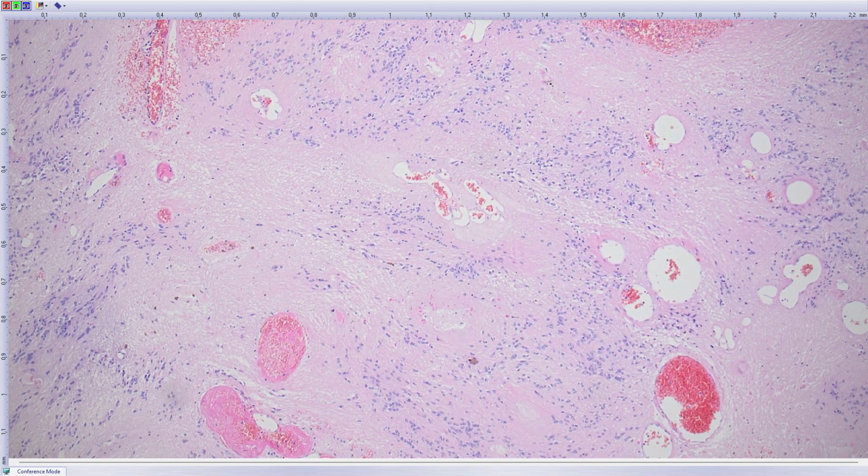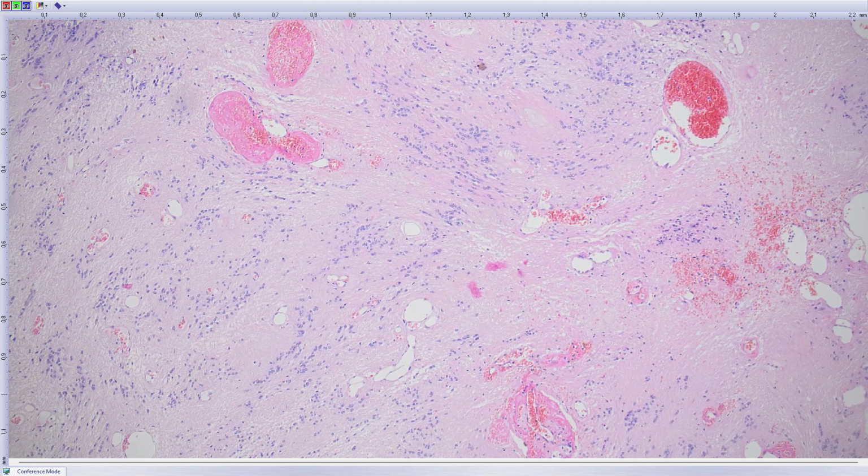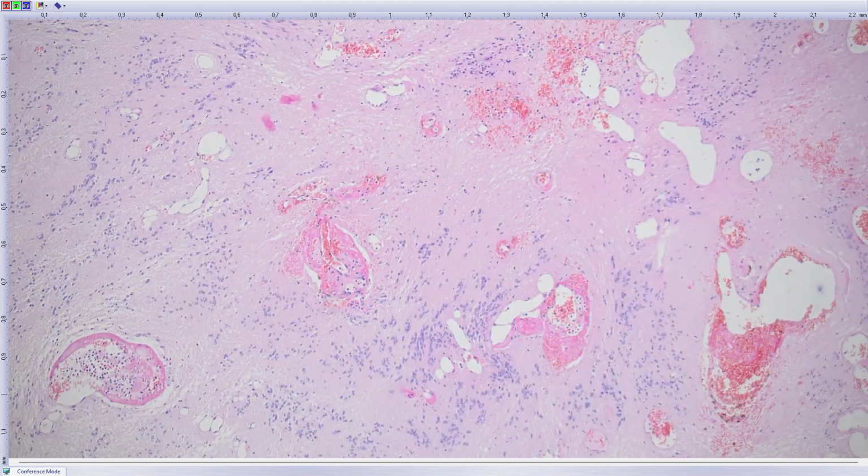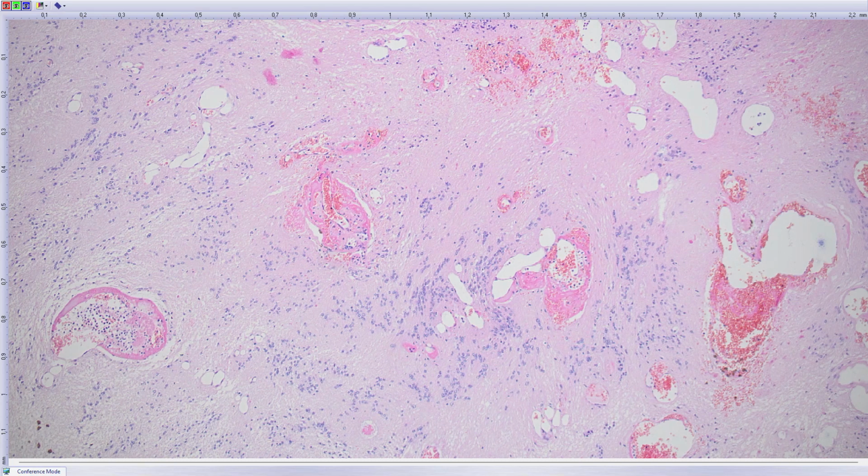So sometimes it's not really helpful for ependymal tumors, but in fact it doesn't matter that much if it looks like this, a really low-grade hypocellular lesion. Even if it came back as ependymoma, I would diagnose that as subependymoma. Subependymoma is grade 1, whereas ependymomas are grade 2, more aggressive tumors.